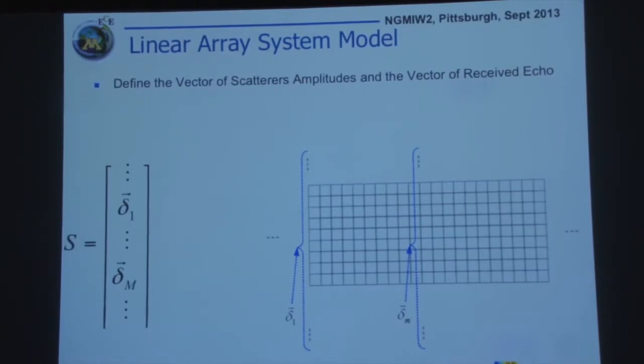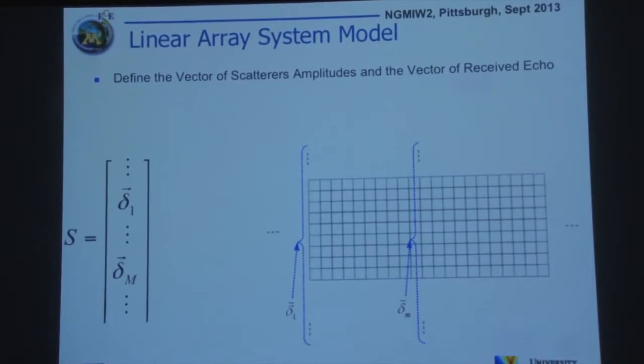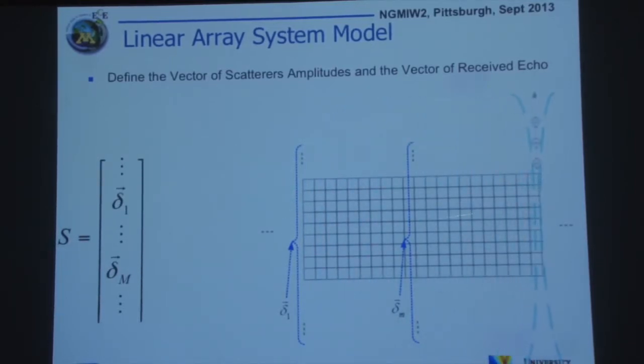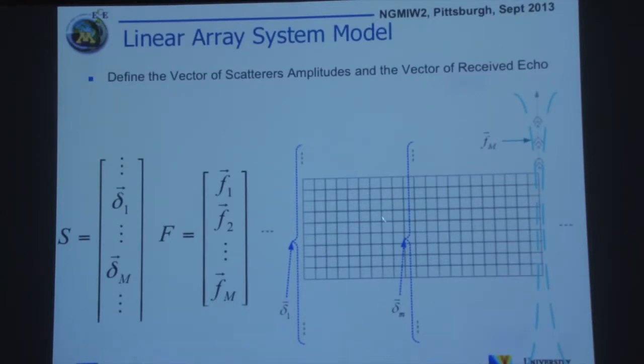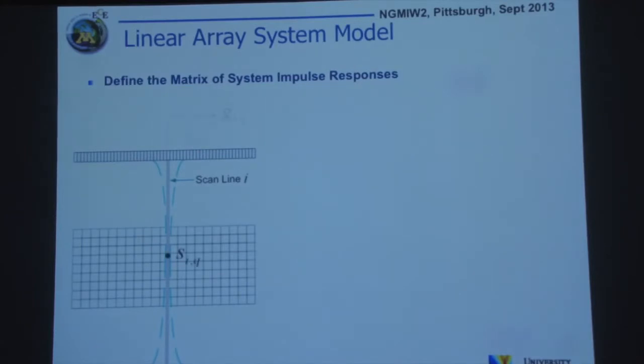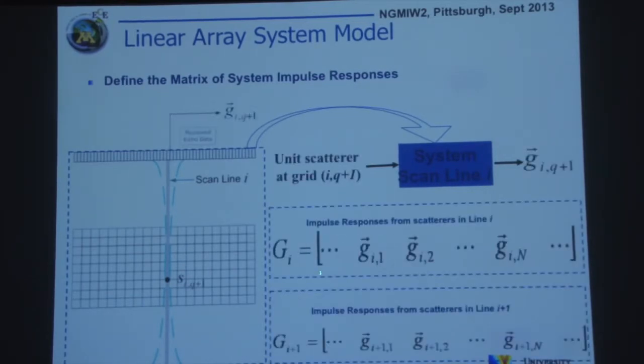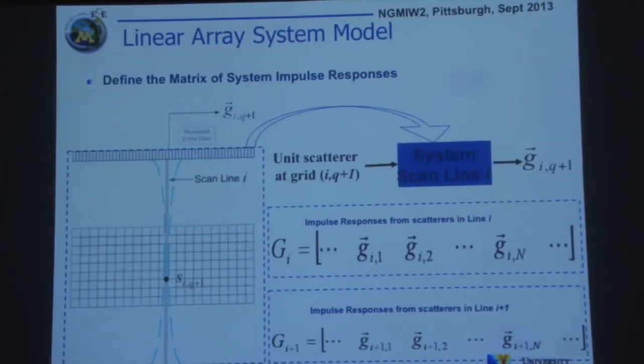Like I said, this was really a tomographic reconstruction, but at a simpler level, and we took advantage of the way a linear array works, where you scan your beam from, say, left to right and so on. So the grid that results is sampled in both axial and lateral direction, and you form a relationship between the scattering strength at every point on the grid and the received data from multiple beams in this case. And the obvious thing is that this leads to a system equation that basically relies on what we call an impulse response matrix for the different points on the grid.